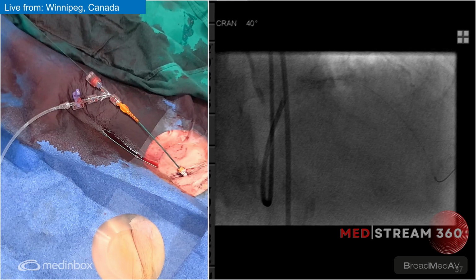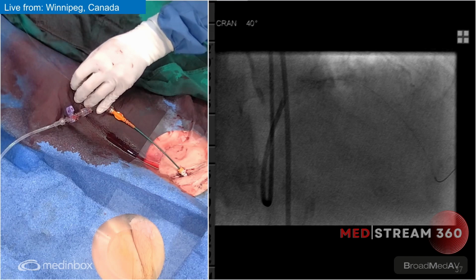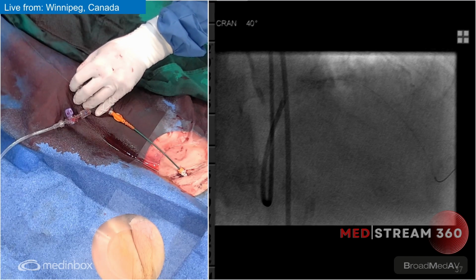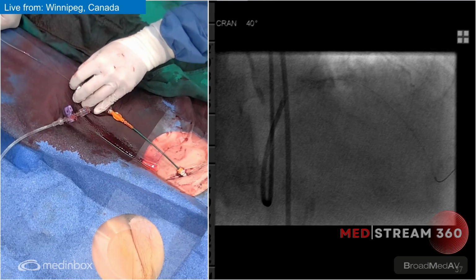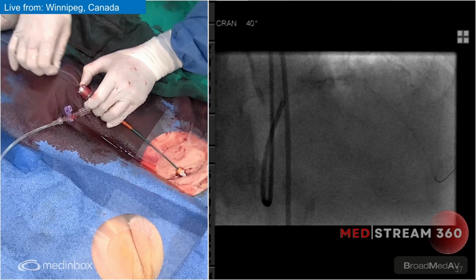I have been fooled before, especially on the single angle angios, to think that the stent is expanded. Do you want the guideline? We got it last time. Let's see. Hopefully the stent straightens out, and in doing so we change the morphology of that ostium. There we go. It'd be interesting to know what other labs use to displace blood as opposed to contrast. Historically we've used contrast. There are other options obviously out there. Saline typically doesn't do the job well enough.